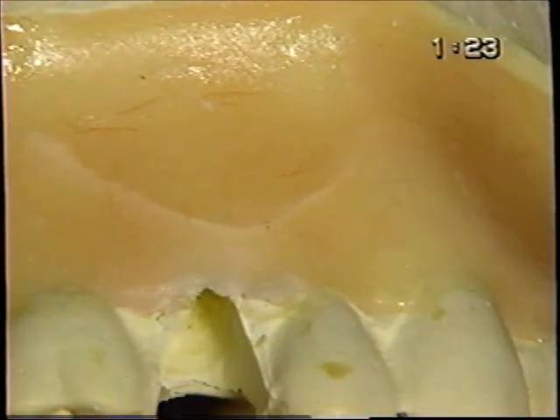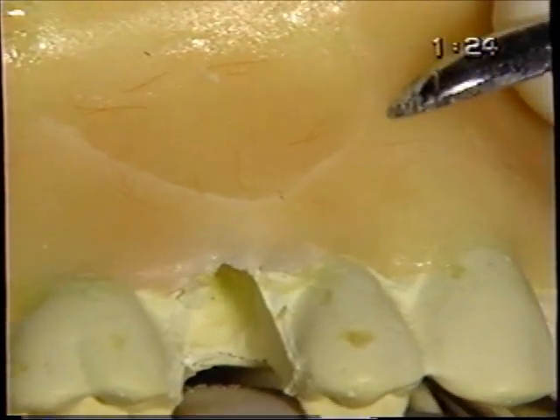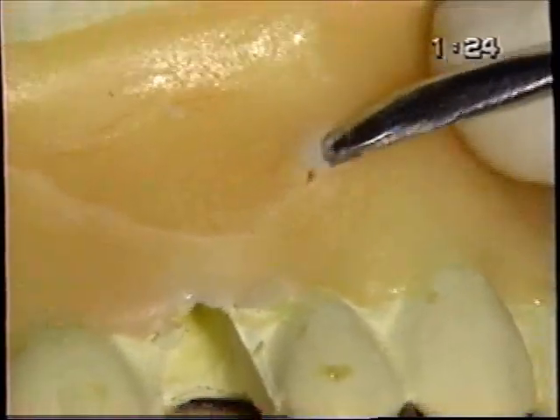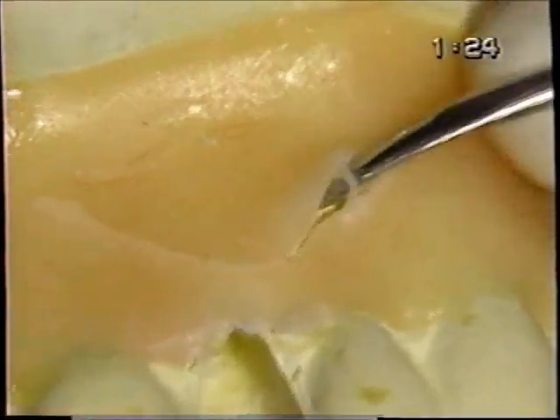What we're trying to do here is to preserve some of that facial plate, knowing that there's a good chance that we'll do an implant there. And the last thing we want is to lose all that bone. So we want to try to preserve it if we can.